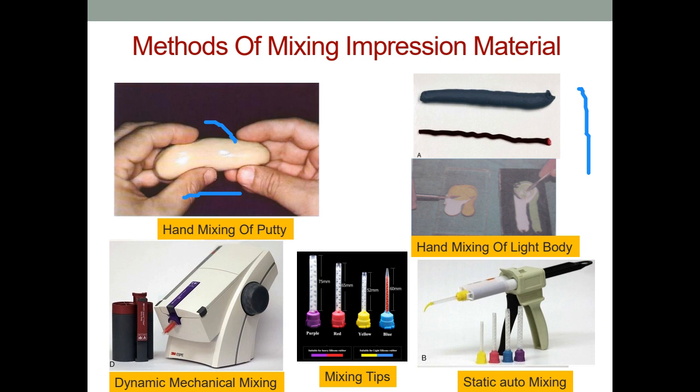Equal amounts of the catalyst and the base are dispensed depending upon the operator's instruction, and mixed homogeneously with the hand, and it is going to be loaded in the tray or in the syringe for dispensing the material in the patient's mouth. Second is the static auto mixing technique.